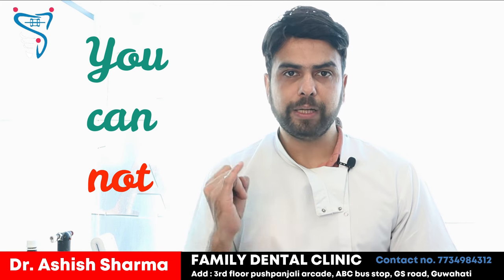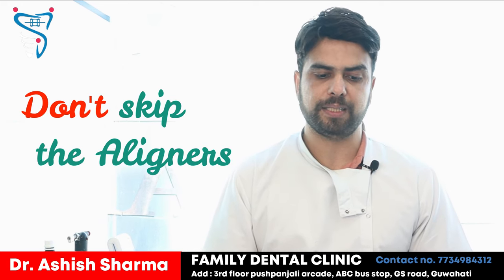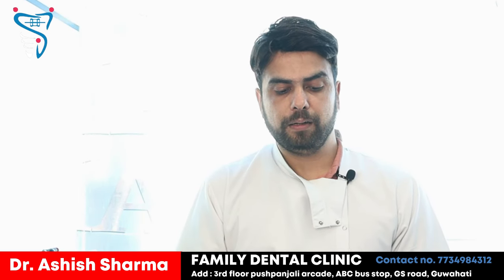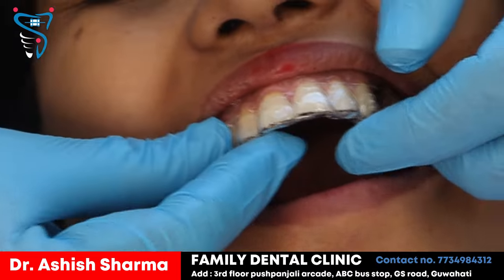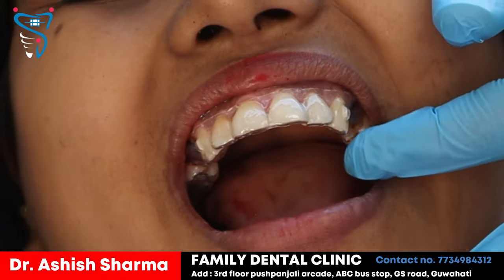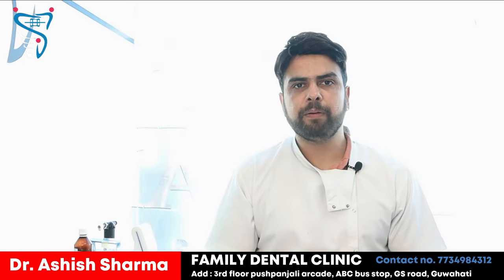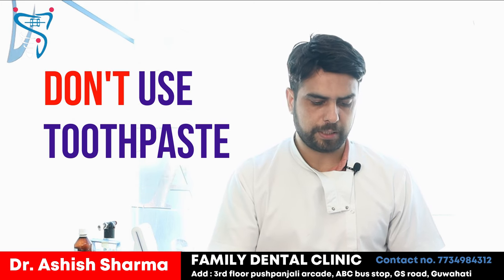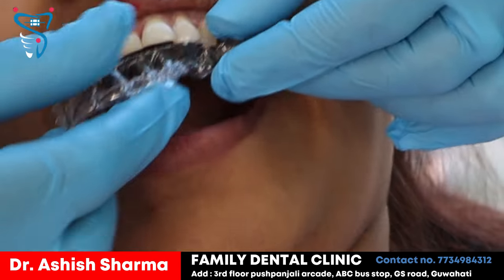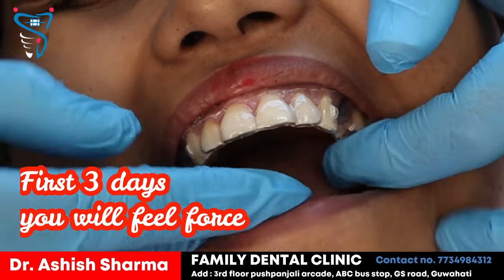The other instructions written in the manual are that you cannot eat, drink, or smoke with the aligners. You cannot do these three things — you have to remove the aligners first. How do we wear them? When you wear it, you push it and it gives a snap fit, meaning it has fitted properly. We explain the patient how to wear it and how to remove it.